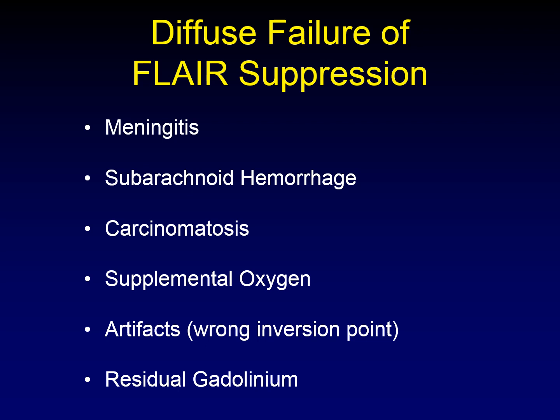Famously, supplemental oxygen causes a diffuse failure of FLAIR suppression — that's why I noted this patient wasn't receiving it, because it would have been a good choice in the differential. There are also a variety of artifacts that can cause FLAIR suppression failure: if anything interferes with the underlying magnetic field, the inversion pulse will be timed incorrectly. This happens with dental amalgam, which distorts the magnetic field — though that is usually a focal rather than diffuse effect.